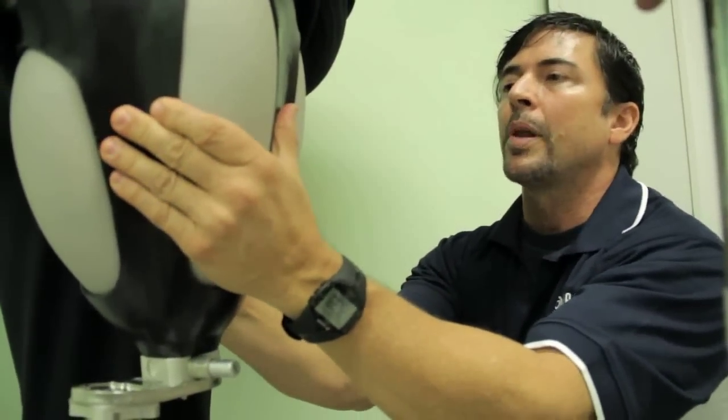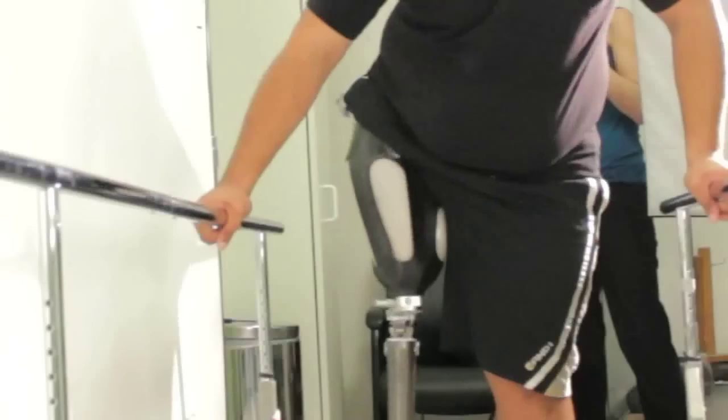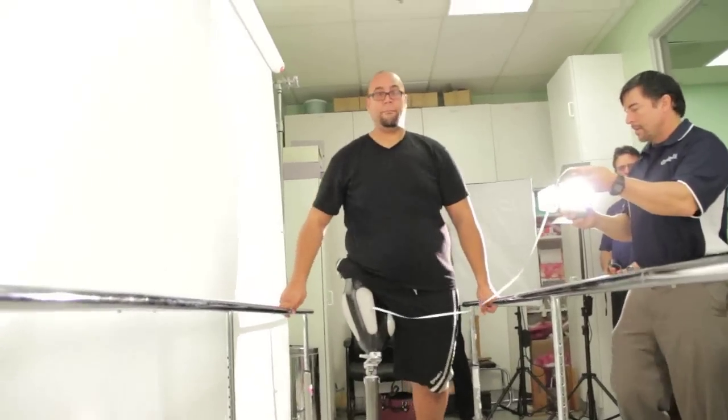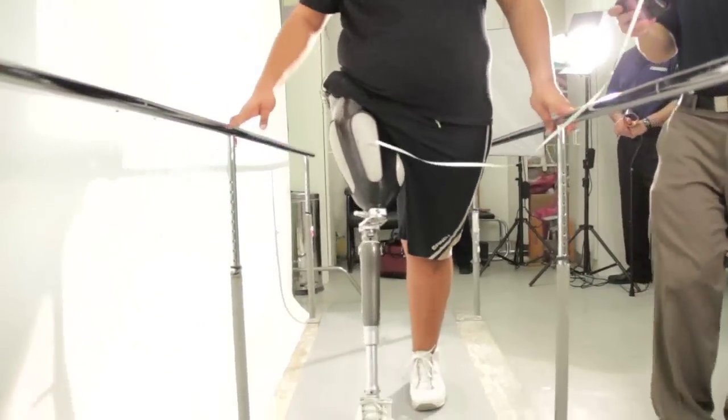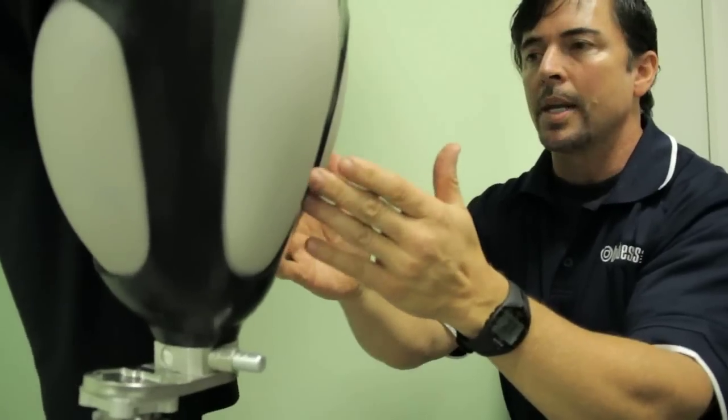If I hold the leg in place, go ahead and move around. If we put on the old prosthesis I'd be able to hold this motionless and he'd be moving all around inside there. But the socket is moving with him. That makes it feel more connected to him and gives him a lot more stability.